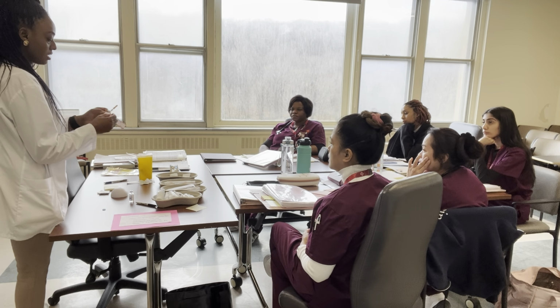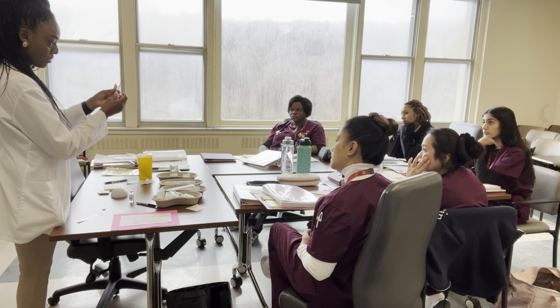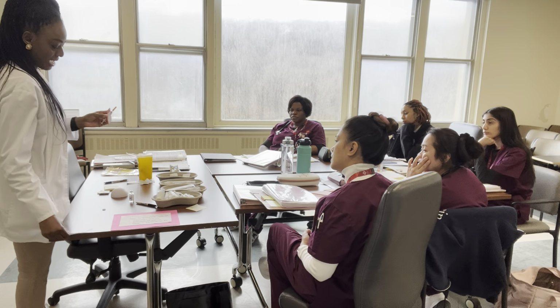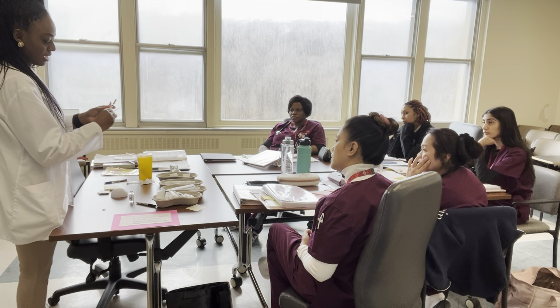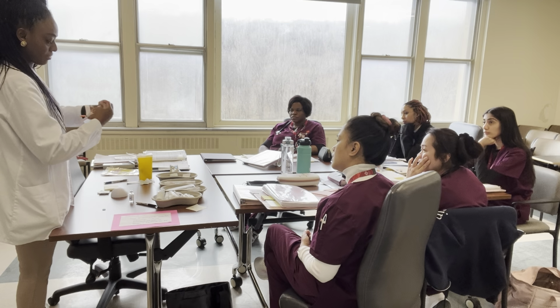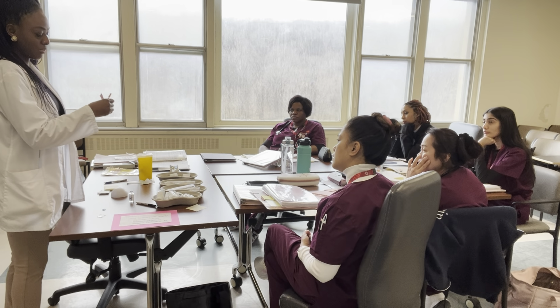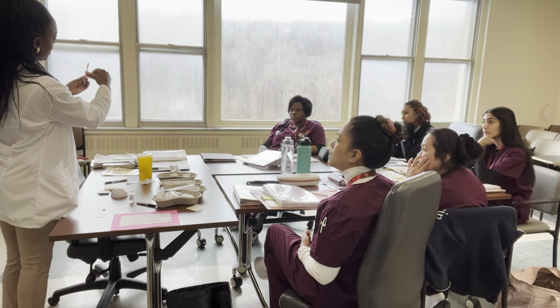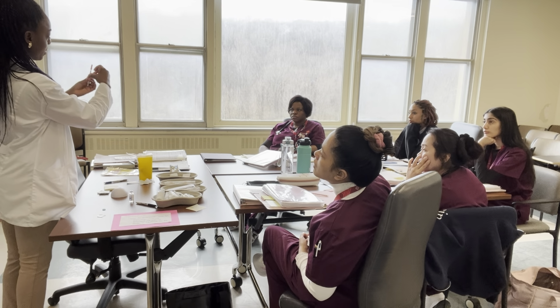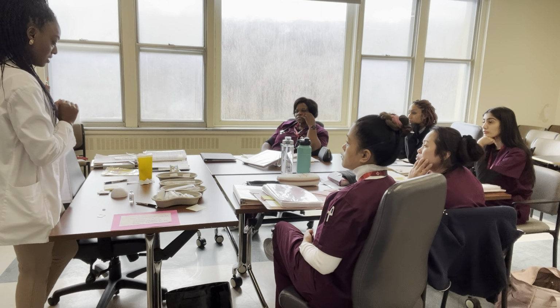I don't want you walking around without labels because that's dangerous. So either you can remove the whole label and wrap it around, or you could put half the label, and then what I like to do is I rip it off, and then when I wrap it around, I'll place it. Always place your label beneath where the number of the medication you're giving is, and then you wrap it onto the paper and it usually sticks. Okay? That's how you would do it.